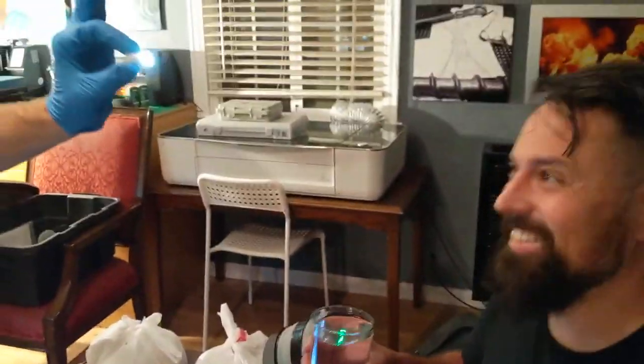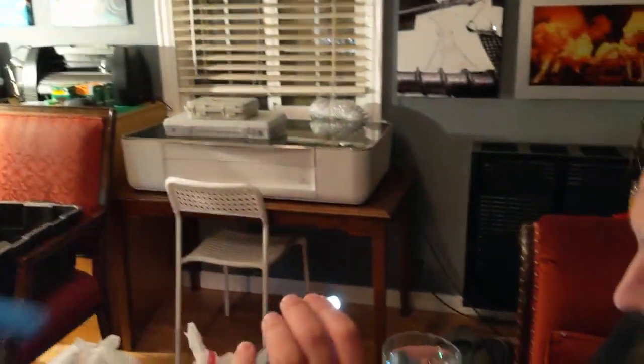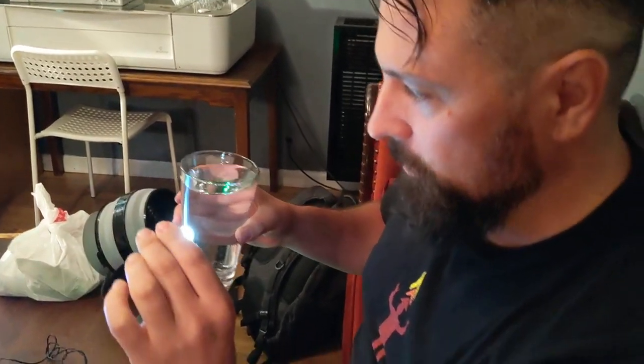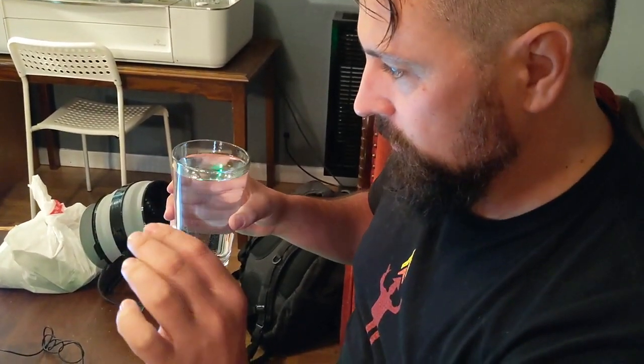First inhuman. Let's see what happens. Alright, so do you want me to do a little power check? Alright, so we're a little hazy, but you know what? We've got motors.